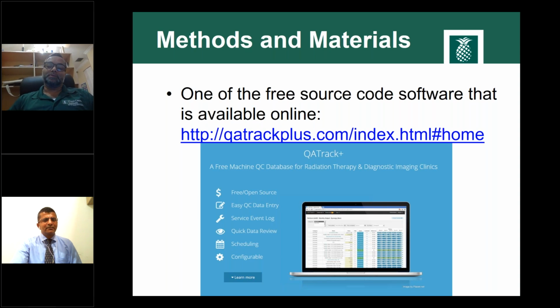2019. We were able to do that, and then 3 months later, the same issue populated. I pulled all the documents from 3 months before, because I was able to put them in the maintenance section: all the information that the field service engineer gave, the communications that the Varian engineers provided, and the physics resolution documentation, all together there.